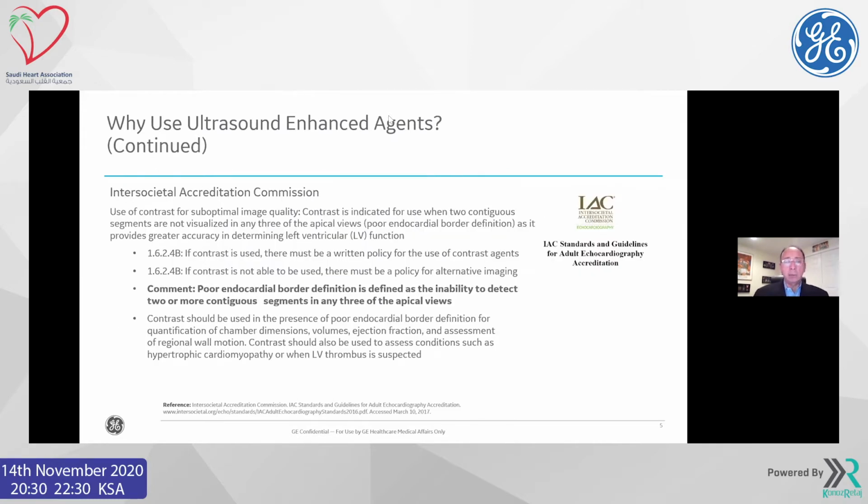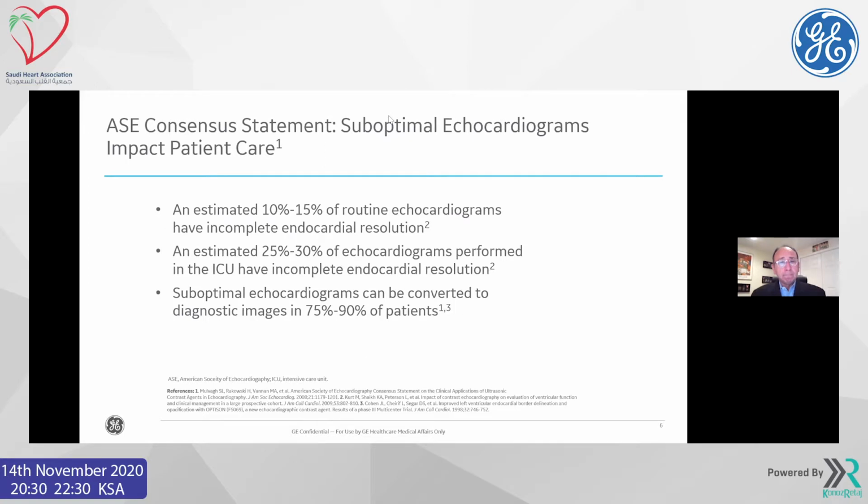And besides that, we also have this accreditation committee here in the United States that is essentially saying the same thing. So for anything that has a poor endocardial definition, then we have the ability to use the ultrasound enhancing agents. That's essentially what the committees and the commission are saying.